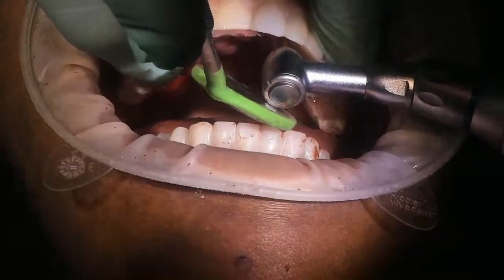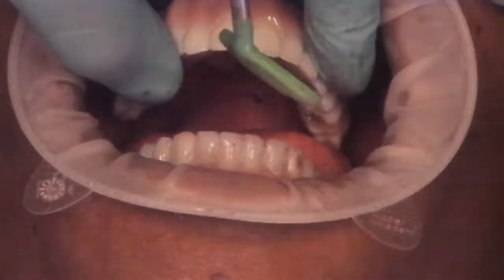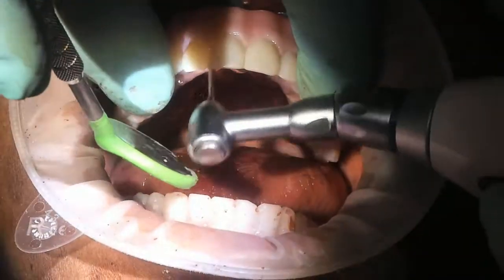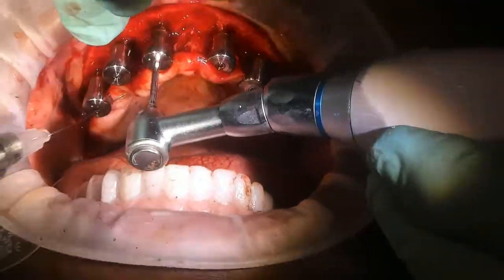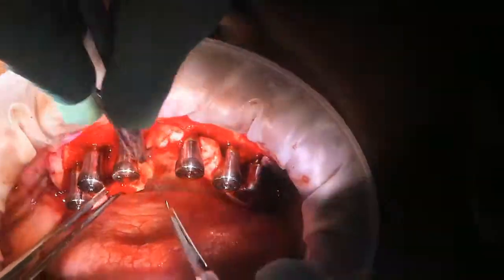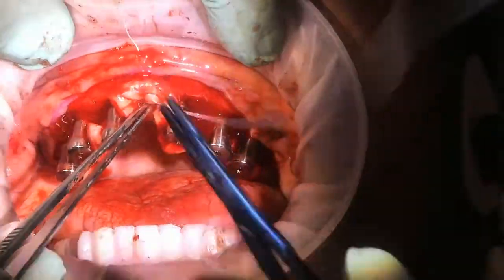And you can use that backup as a way to transfer the records to the laboratory. It's a simple process to transfer all the records, implant position, tooth position, occlusion, bite, everything. Very handy. Then the rapid appliance is removed, with the blockout gaskets and the carrier guide, and then the fixation base is also removed. And if the doctor chooses, comfort caps are placed and the patient is sutured. And then we move on to the opposing arch.